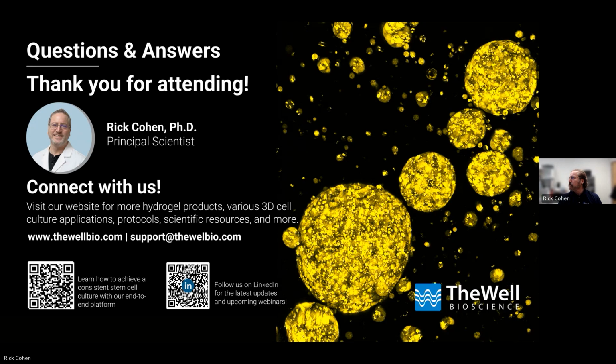Thanks. Thank you, Rick. What are recommended seeding densities to achieve maximum expansion efficiency without compromising pluripotency? So what's great about our system is it's really tuned to maintain pluripotency and viability with the enhancer. So we recommend in the 24-well format, that's a lot of the times where we'll do assays, to go no lower than 50,000 cells per well and no more than 150,000 cells per well.